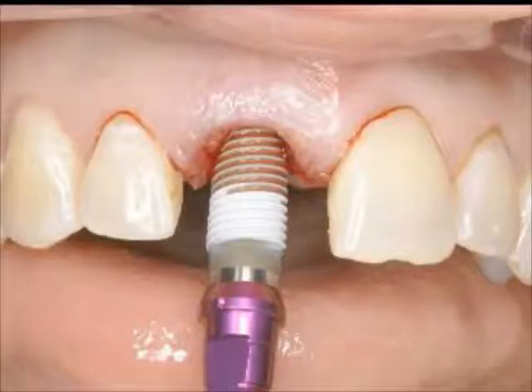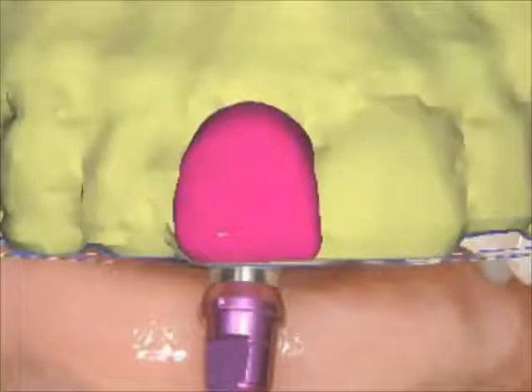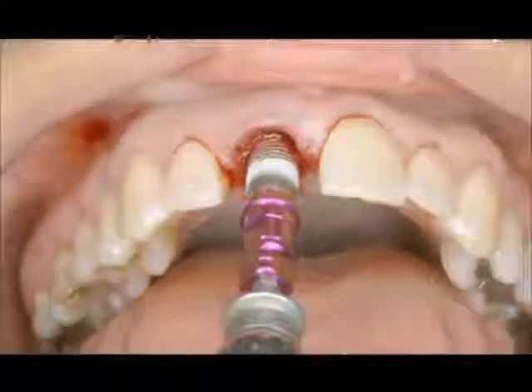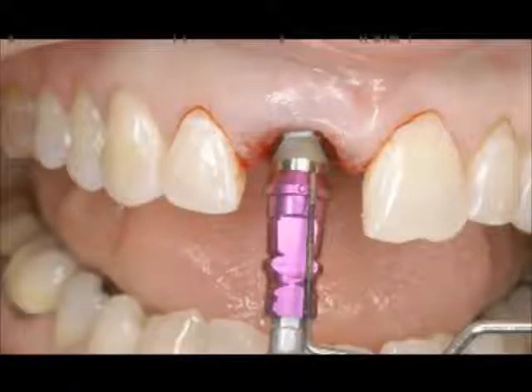This is again based upon the 3D scan and where that tooth is going to be, and then inserting the 4.7 millimeter tapered screw vent implant, hugging the palatal bone, and compressing the autogenous grafted bone against the buccal wall of the socket. And this is what it looks like.